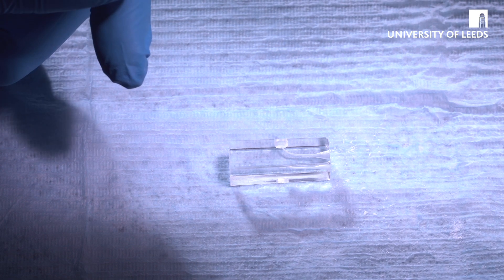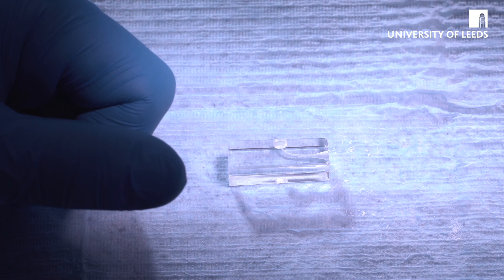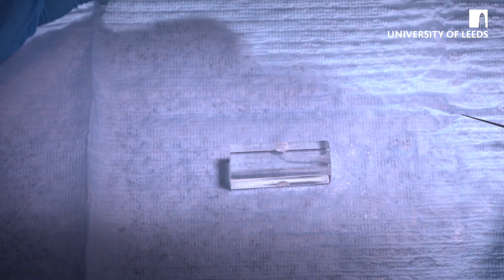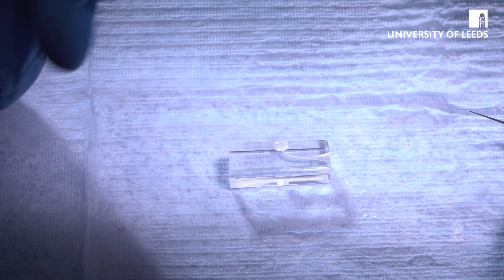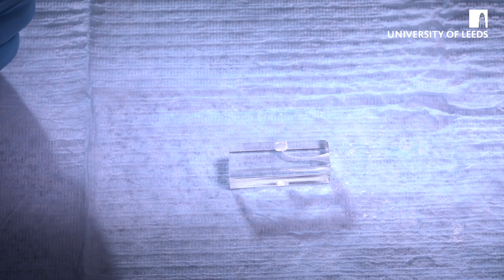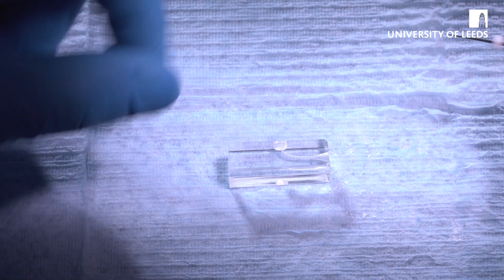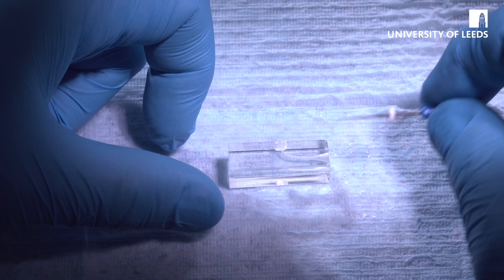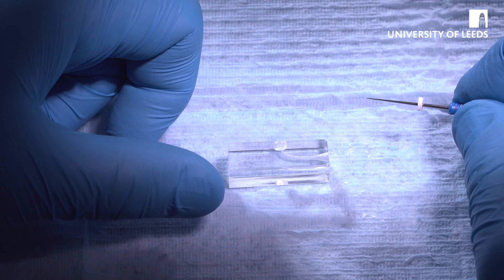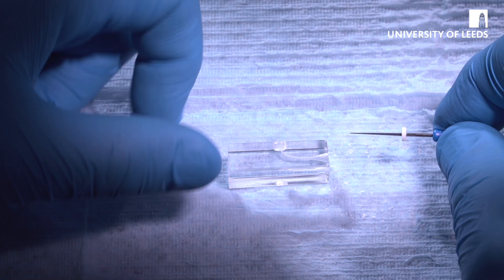So the first step is to select your finger spreader. You know what you prepared the canal to — in this case it's to an F2, so that means it's a 25 MAF size with a taper of 8%. That means you're looking at either a B or a C finger spreader. This is a C finger spreader, and you want to get the finger spreader to within two to three millimeters of the working length.